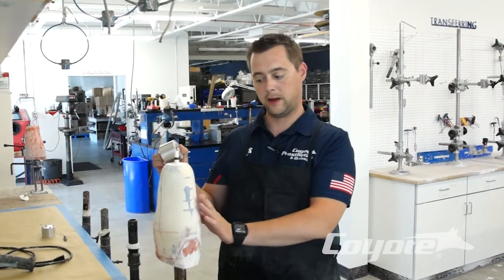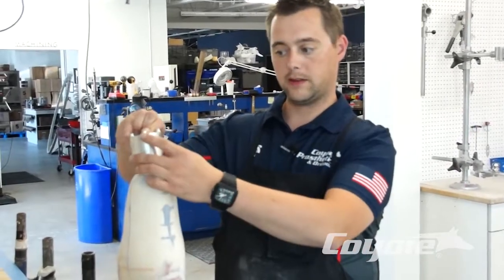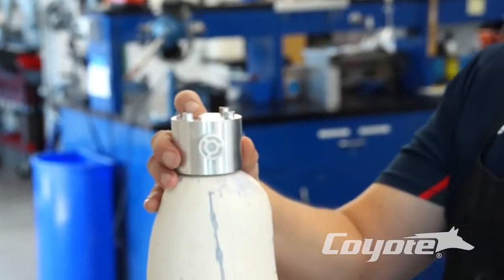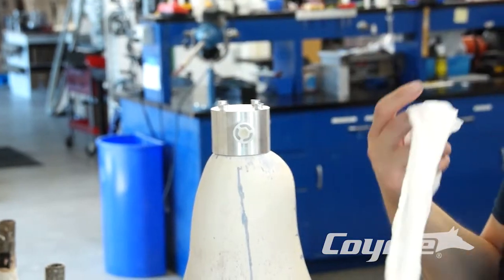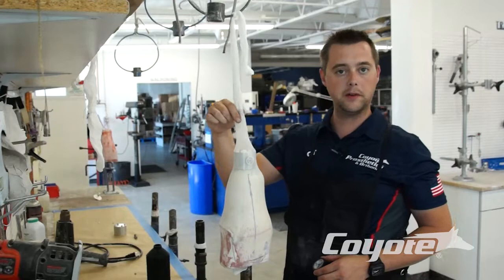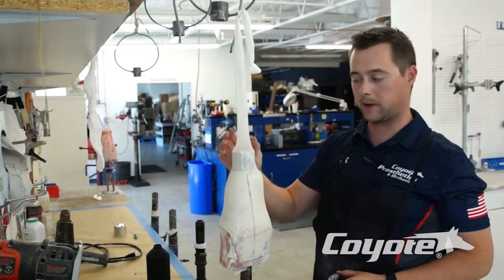Getting ready, prepping for lamination or cast — it's nice and smooth. We're going to just set this in place on the medial side, put a little bit of clay in that center hole, and grab a real thin pantyhose sheer vacuum nylon. So we have our vacuum nylon on, pulled over our cast and over our fabrication dummy.